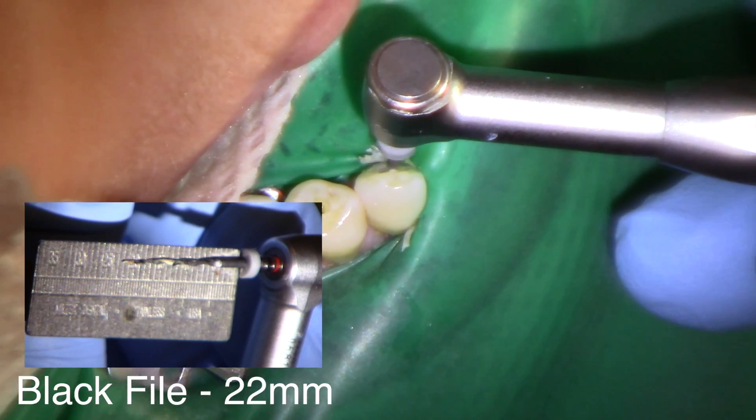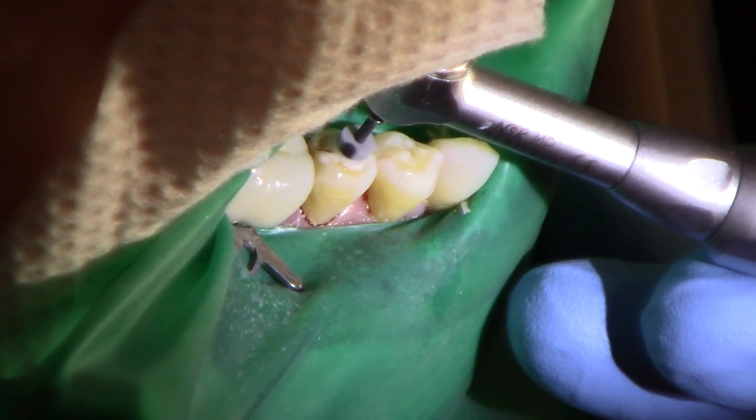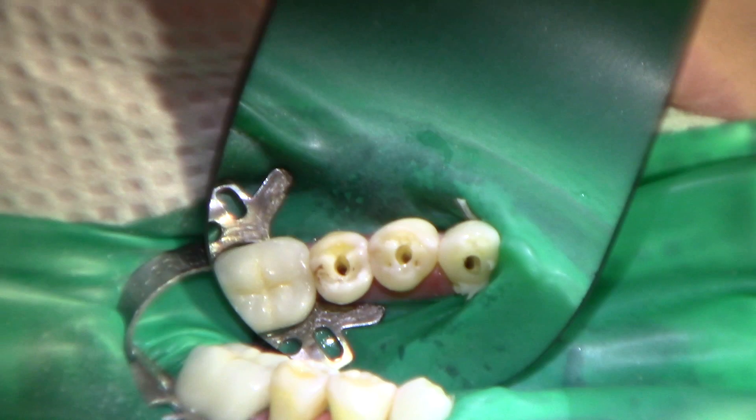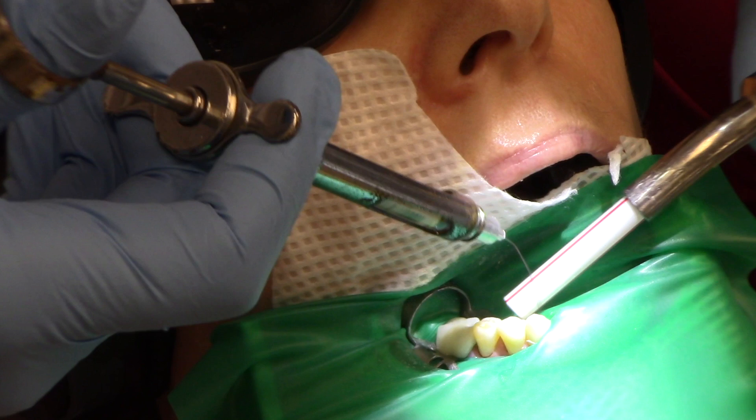Now back to the black file — now it will go to place. It's a wonderful, revolutionary system. Then I'm going to irrigate everything out, and then irrigate with local anesthetic.